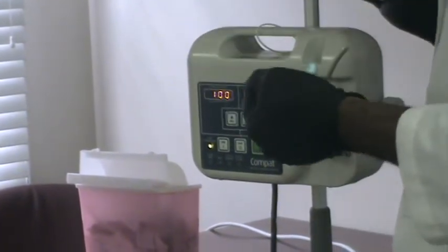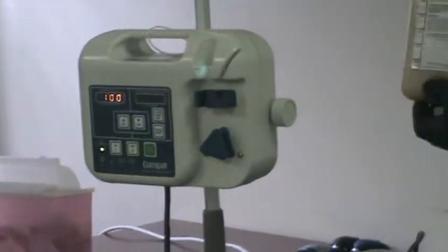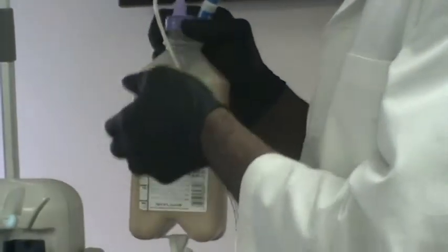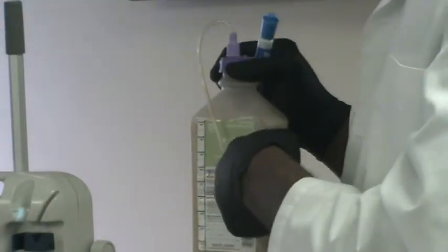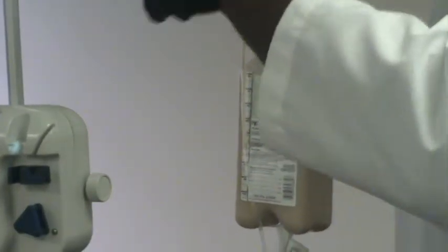Another reason is, let's say, this comes in a 1,500 bottle, but this bottle is 1,000. So in her case, she's getting one bottle per day. But some people might need one bottle plus another 200, which will have to come from a second bottle. When this one finishes, you hang another bottle to complete her feeding for the day.